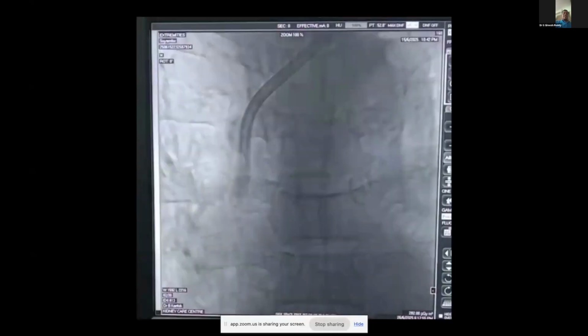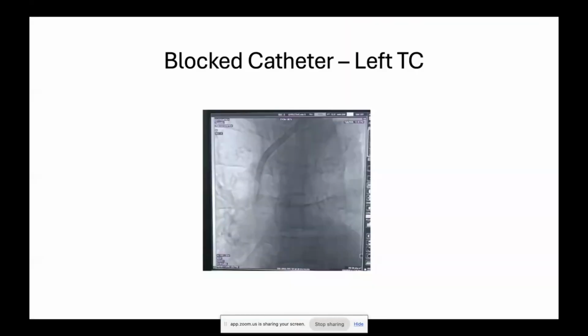Basically, this is a case of a 75-year-old who has been on maintenance hemodialysis for almost 5 to 6 years, and also with multiple access failures. Almost all the access has been exhausted. Both RC fistulas were primary failures, and the right BC was a secondary failure, and transposition was attempted. On the left side we attempted an AV graft, which failed because of graft thrombosis.